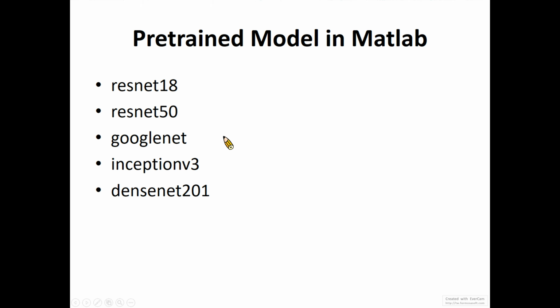So I think this will conclude this week's workshop, and I hope you learned more about how to do deep learning in medical imaging data. In the next week, we will move on to the brain CT image. It is more challenging, but it is fun. The principle is the same. We will still explore how to use the simple model and the pre-trained model to do the training on the brain CT data, or even more difficult, MRI imaging data.